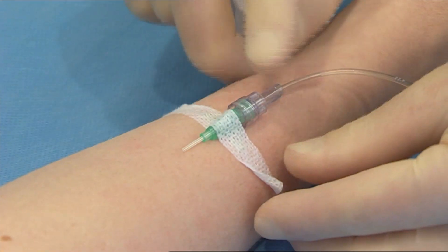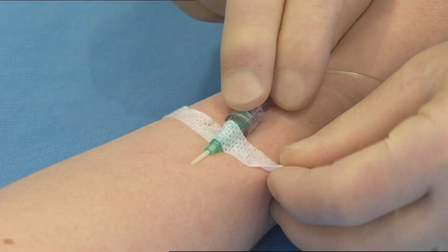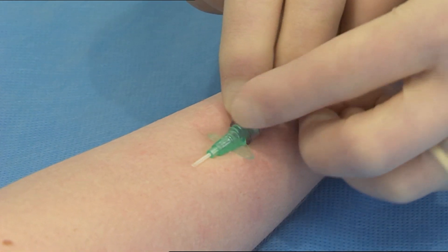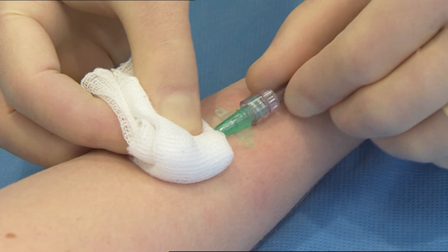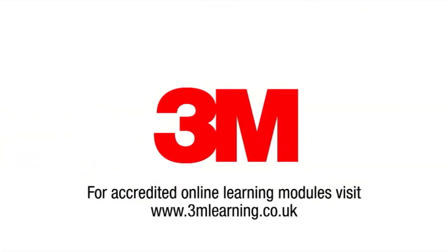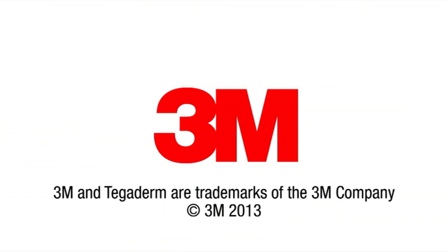Carefully remove the remaining securing strip whilst holding the catheter in place. Carefully remove the dressing.